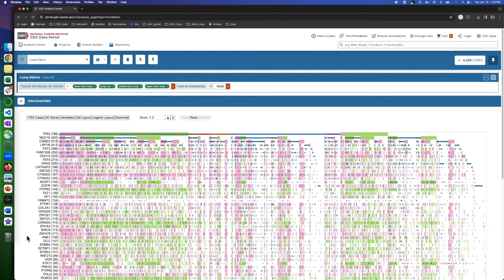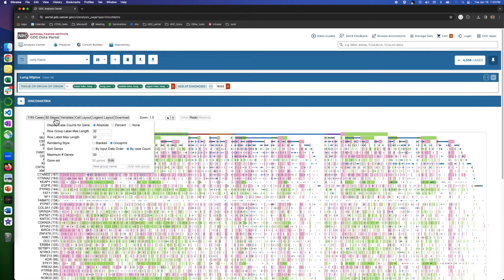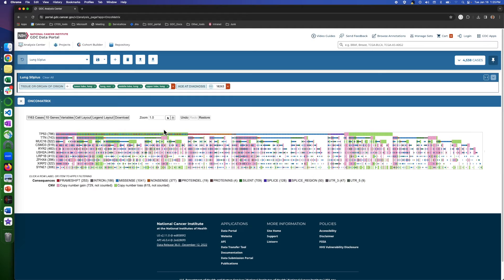We have 50 genes here, and we want to limit it to the top 10 genes for demonstration purposes. So we click on 50 genes, and the second button down, we have maximum number of genes. We change it to 10, and you see only the top 10 genes will show up. The number of cases will also be updated from 1,193 to 1,163.